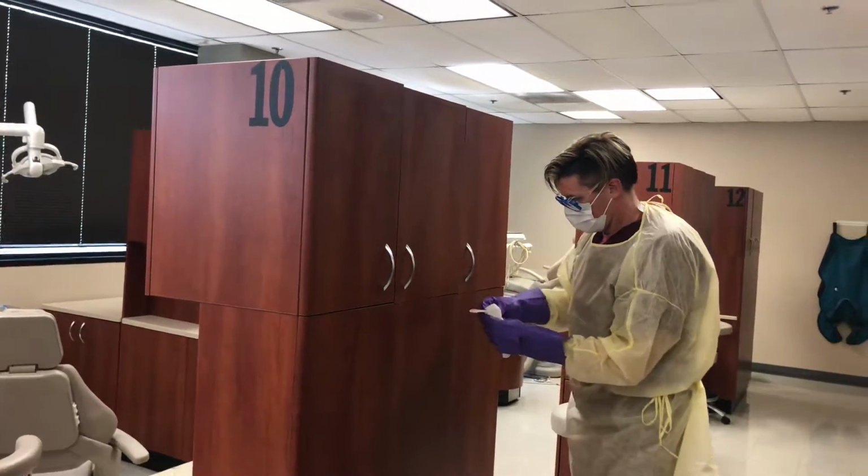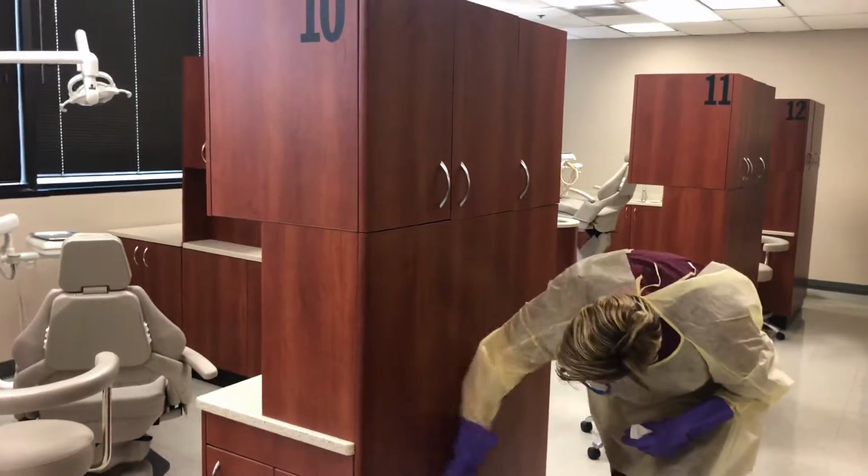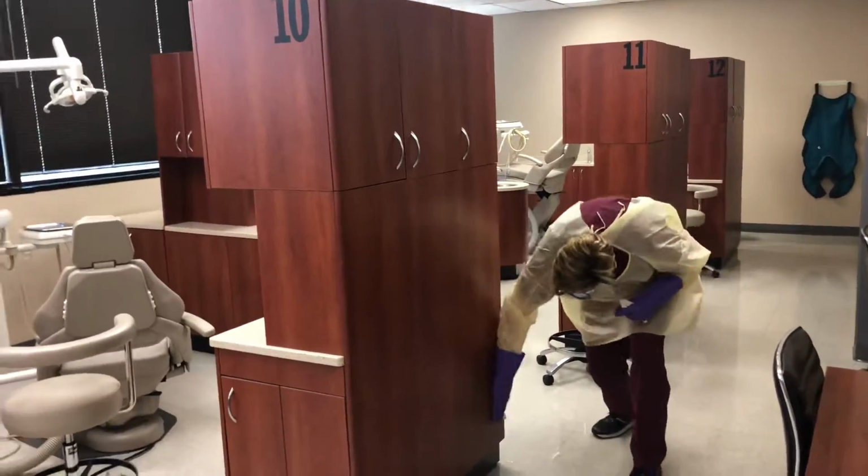Notice how he has done a full 360 degrees around this back cabinet. This cabinet, we refer to it as the 12 o'clock cabinet.